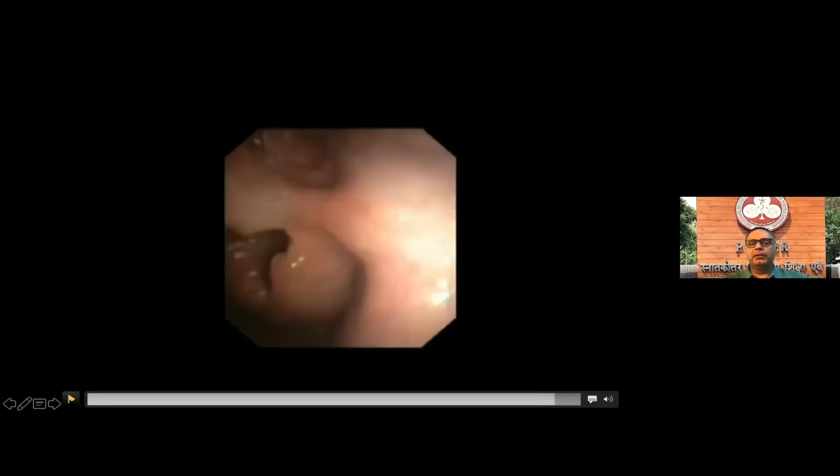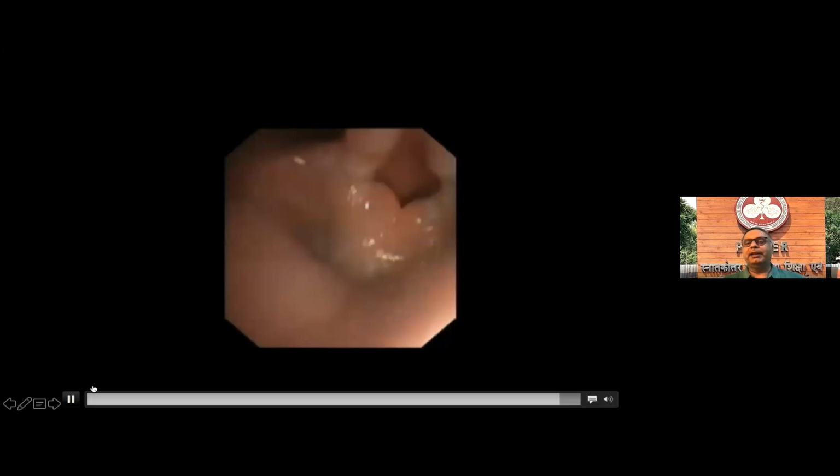This is the post-operative picture. So you can see, I've paused the video. You can see the AE fold which has opened up. This is 10 days post-op. So see the lack of slough formation and charring. It heals very well because the collateral thermal damage is very, very minimal because of the low temperatures. This is the right side AE fold. That is the epiglottis. And you can see it is not touching the posterior pharyngeal wall anymore. It has opened up and has moved anteriorly.